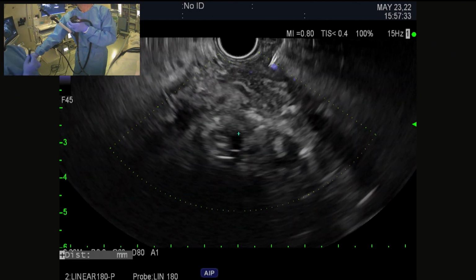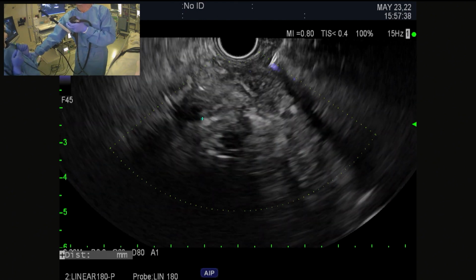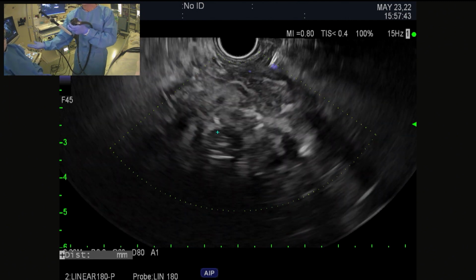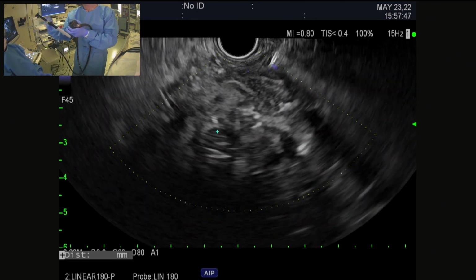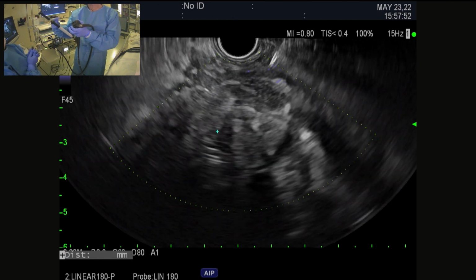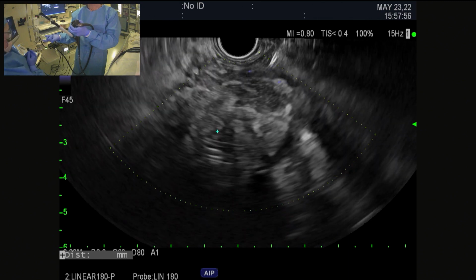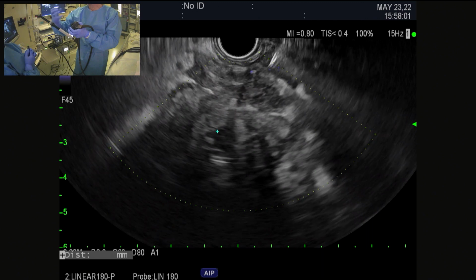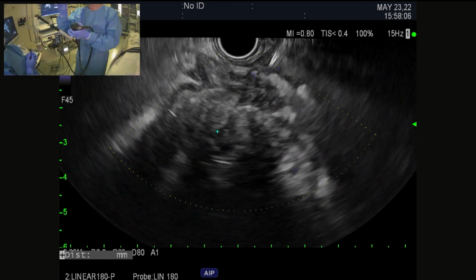Look, this is a fluid collection down there. There are all these pockets. This is all loculated, right? This is heavily infected. This has been going on for a month and a half, so this should have been done a long time ago. The patient also has not been undergoing percutaneous irrigations. He has a catheter in place, but it's only to drainage. No one's irrigating the collection. See, that is the mistake. You have to have movement, a closed circuit and movement. If you have stasis, everything gets infected, and this is what you end up with.